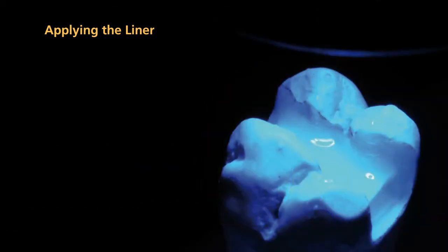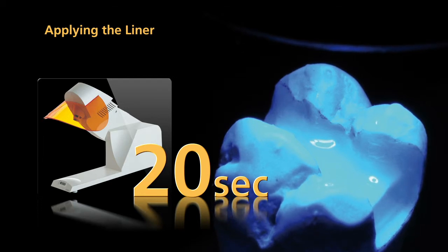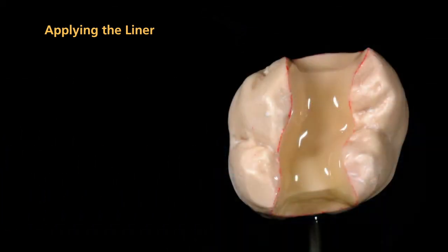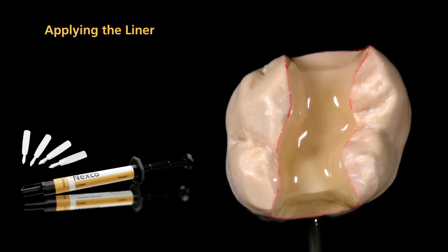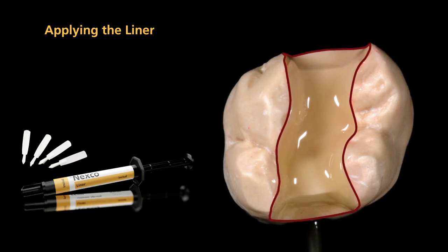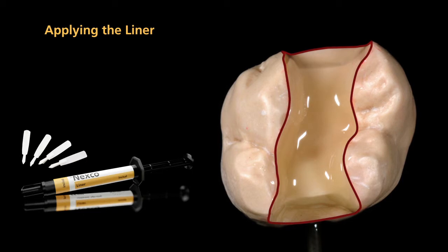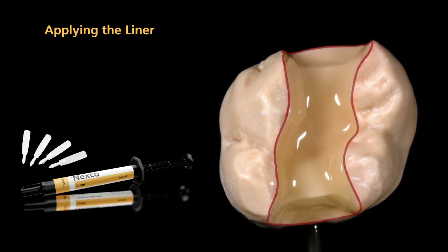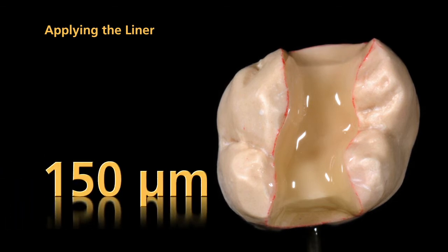Pre-cure each segment for 20 seconds using a quick pre-curing light. Now apply the second coating of liner. At this stage, apply liner incisal to the marginal areas and along the course of the enamel. All cavity surfaces should now be coated with liner. The thickness of the liner coating should be at least 150 microns.